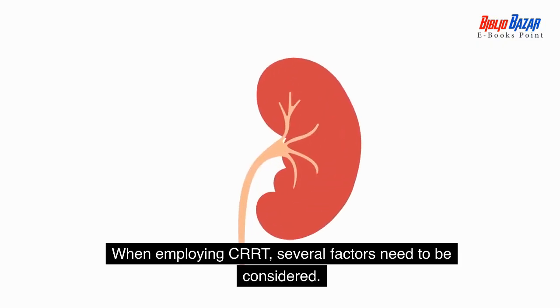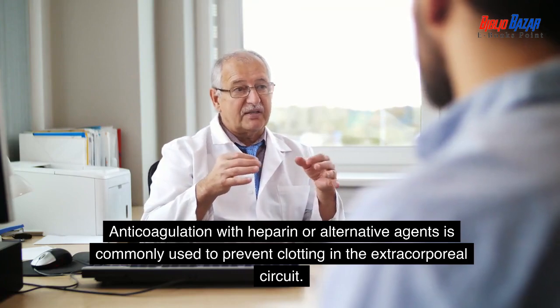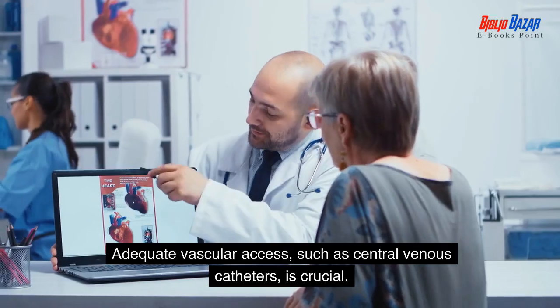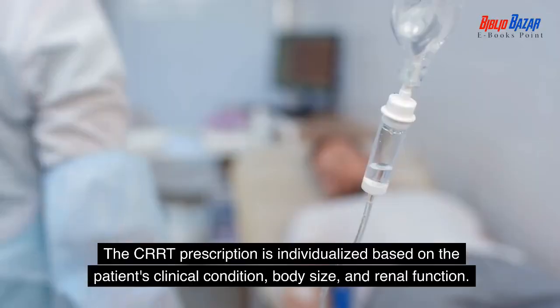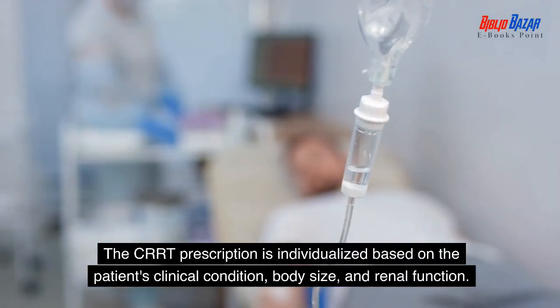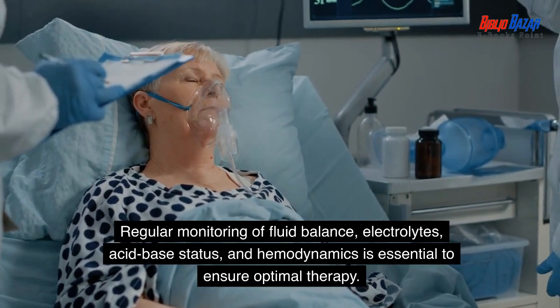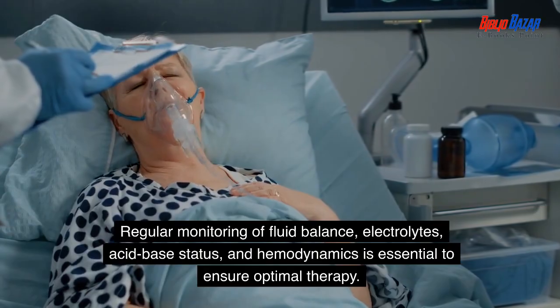When employing CRRT, several factors need to be considered. Anticoagulation with heparin or alternative agents is commonly used to prevent clotting in the extracorporeal circuit. Adequate vascular access, such as central venous catheters, is crucial. The CRRT prescription is individualized based on the patient's clinical condition, body size, and renal function. Regular monitoring of fluid balance, electrolytes, acid-base status, and hemodynamics is essential to ensure optimal therapy.